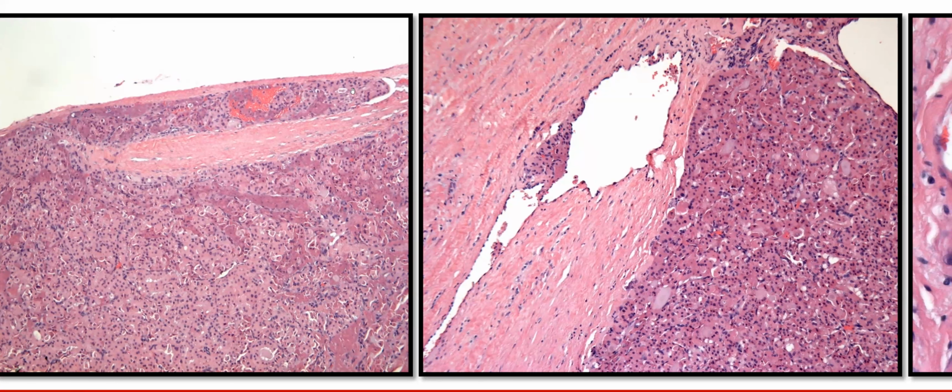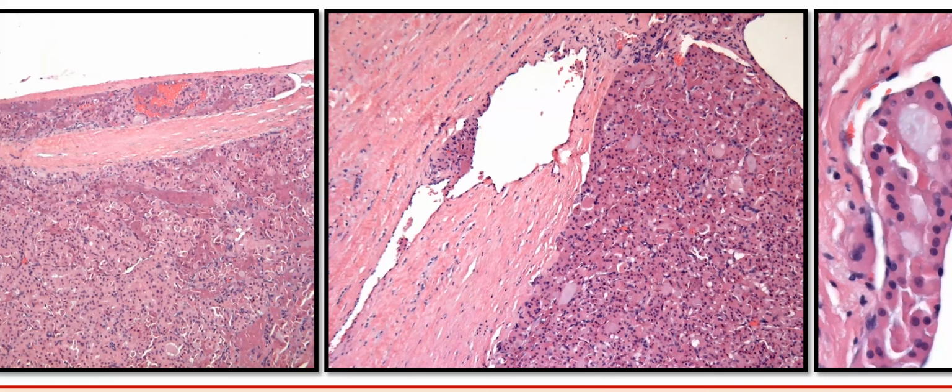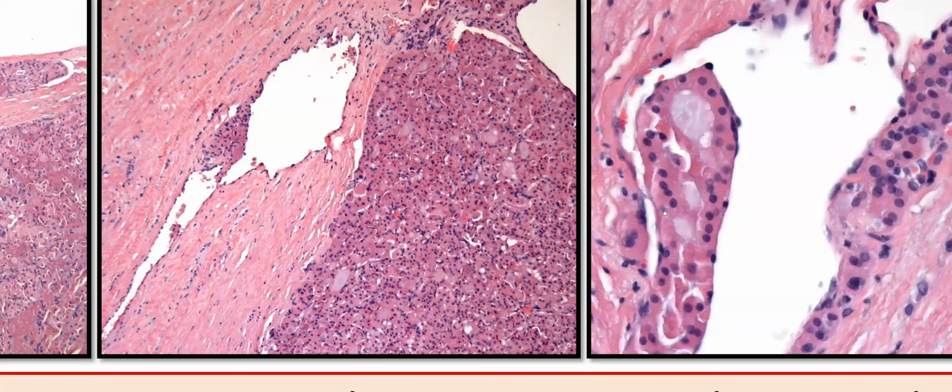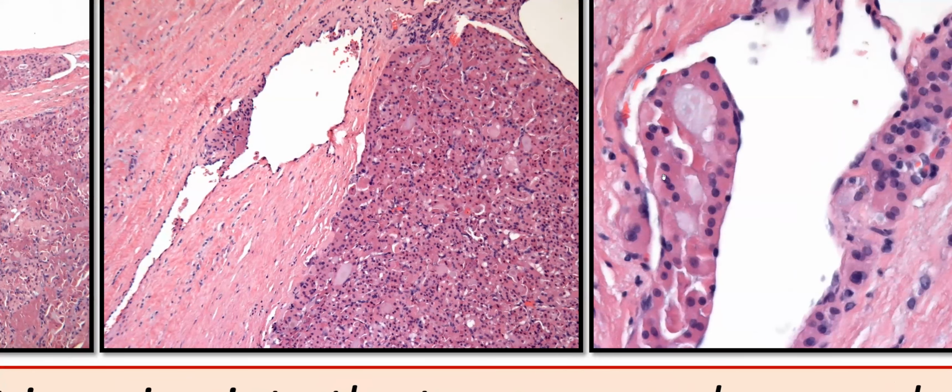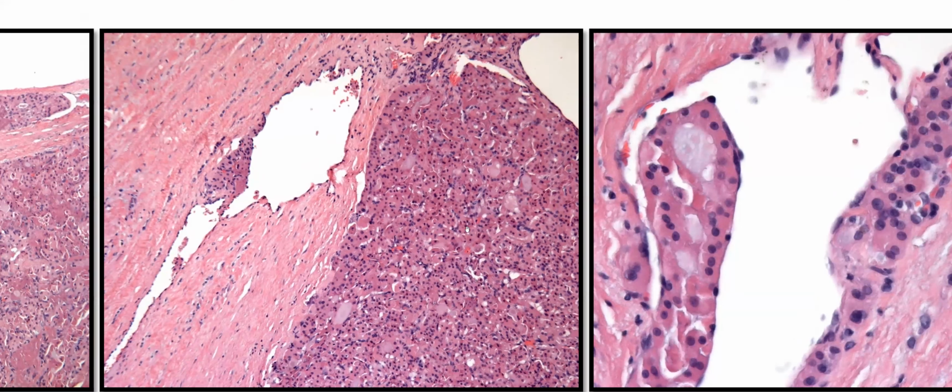That is the direct invasion into the vessel, and you have to be very careful in diagnosing this, because you want to see that space of a vessel where the tumor is invading into. Vascular invasion, what I personally really like is the attachment of either a tumor thrombus to the wall of the vessel, which is surrounded by endothelial cells. So there's the tumor thrombus, which is attached to the wall of the vessel, and you have endothelial cells surrounding on all 3 sides.